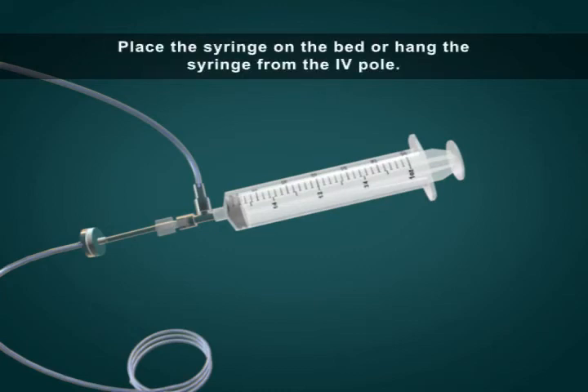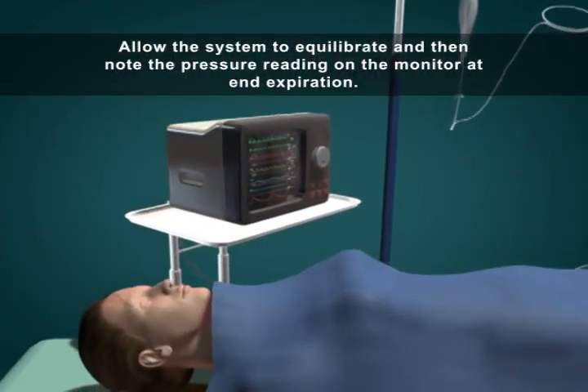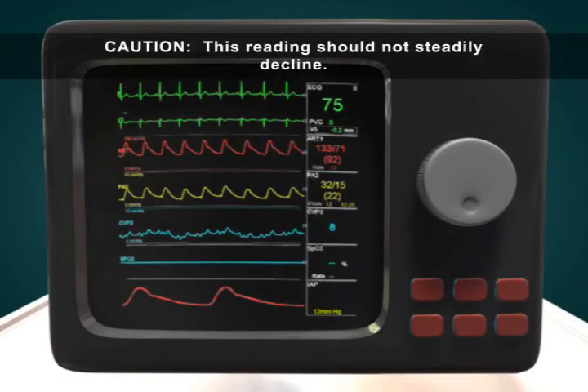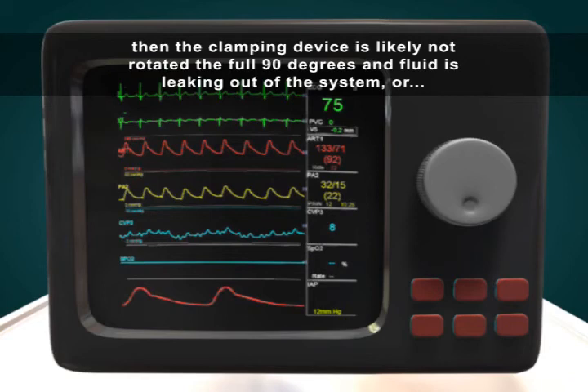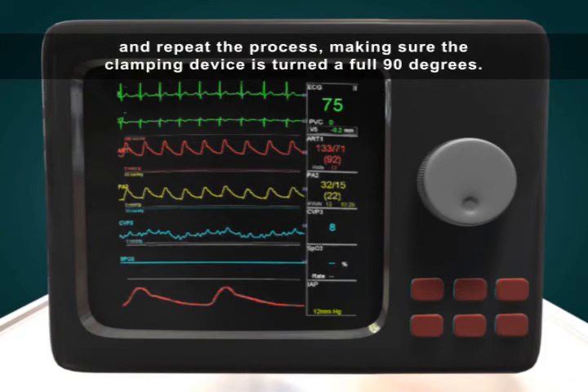Place the syringe on the bed or hang it from the IV pole. Allow the system to equilibrate and note the pressure reading on the monitor at end expiration. Caution: this reading should not steadily decline. If the pressure reading drifts down, the clamping device is likely not rotated the full 90 degrees and fluid is leaking out of the system, or you have a luer connection leak. Drain the system, check the luer connections, and repeat the process, making sure the clamping device is turned a full 90 degrees.